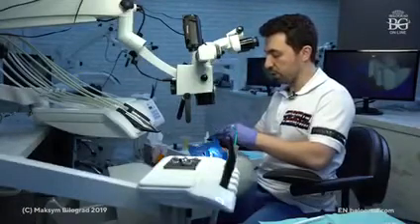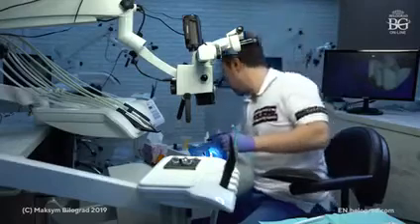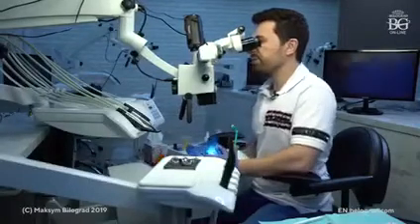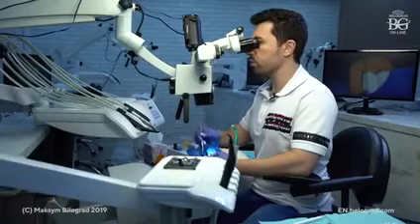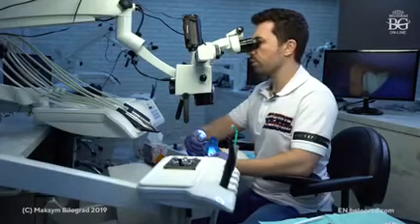Let me just check also. Let me check this premolar to be confident that everything is fine. Okay, the occlusal surface and also buccal surface 0.4, 0.5.